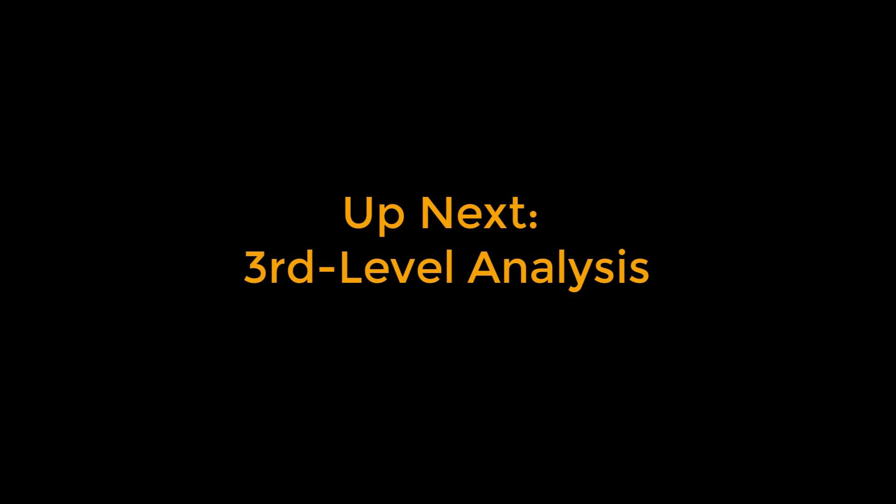Once you've reviewed the data, you're ready to move on to the last part of statistical analysis, third level or group analysis.